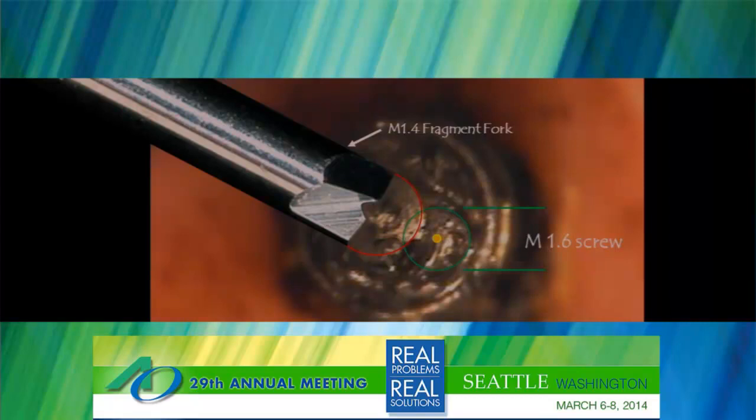And so you can see that there was not a lot of visualization going on here, which is one real big problem in removing these screws. And the other issue was even if he had been able to see what was going on, the problem is that he had the wrong tool, and it was not guided.